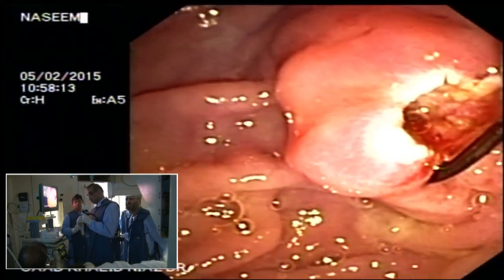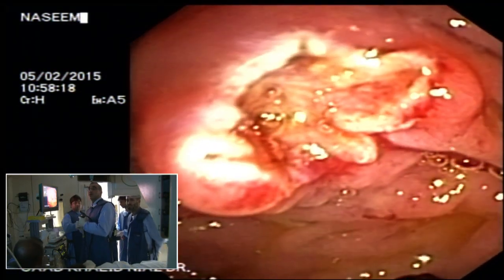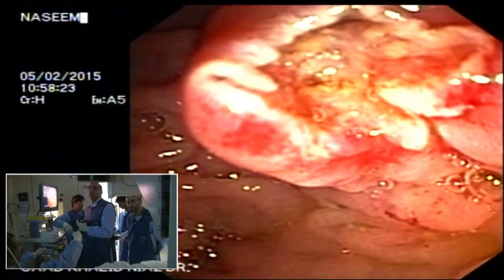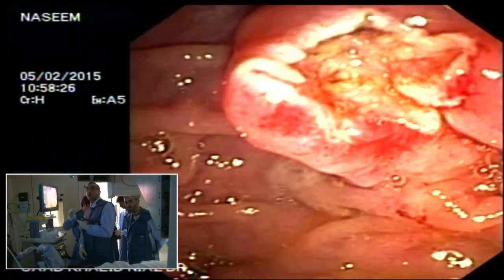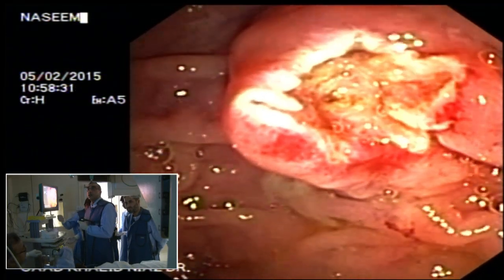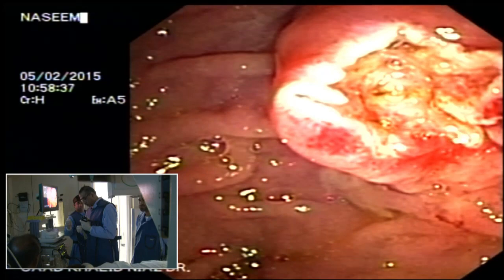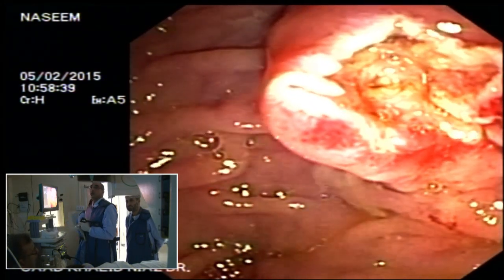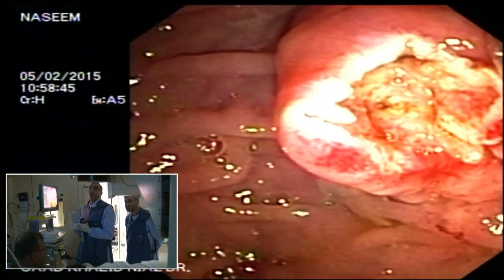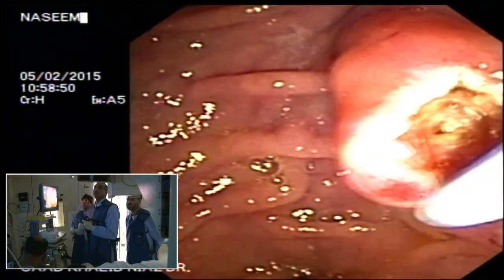Keep in mind that you all reuse wires excessively. I think we've lost our pancreatic wire anyway. Not to worry. The tip is not as smooth as it is the first time. You can see the opening there, beautifully put. Can you all see it? The opening is right there, and then the muscle around it. You see the bile coming around there.